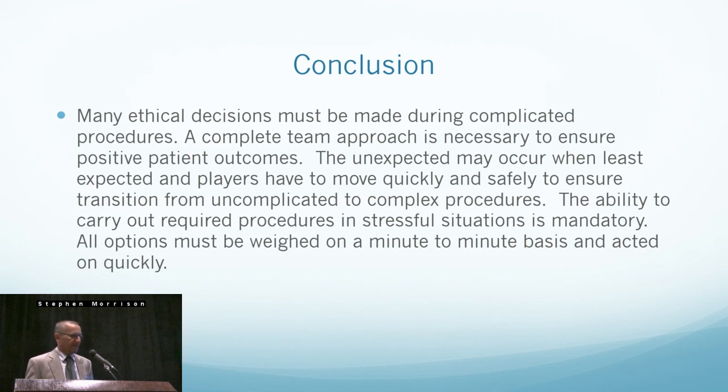I agree with that. But now you hear conversations with people, well, maybe we don't need a prime pump. It's like, whoa, okay. I've only had to do 3 crash-ons, and I didn't have a prime pump. You weren't going to save anybody. There's no way, shape, or form. It would have taken me too much time. You're already doing CPR on the patient. You're trying to get the cannulas up. You're trying to get the circuit primed. You're trying to pass them up to the surgeons, and they're busy waiting, yelling at you for it. So I think to even consider going that route is probably a step backwards. I hope that we never get to that type of situation.